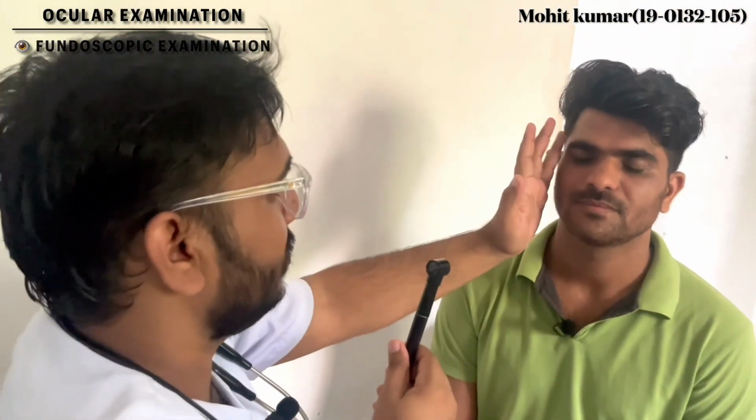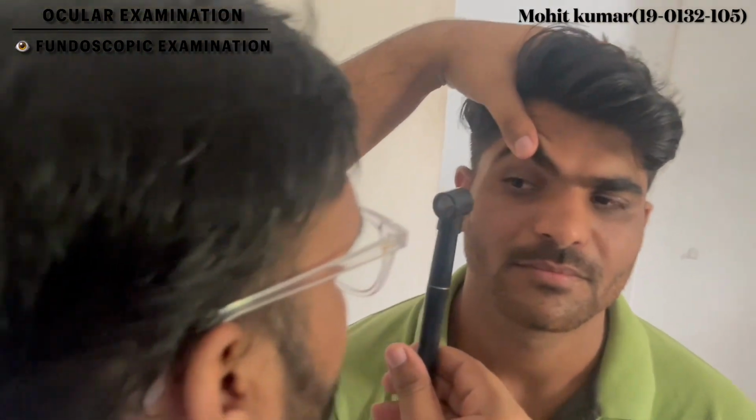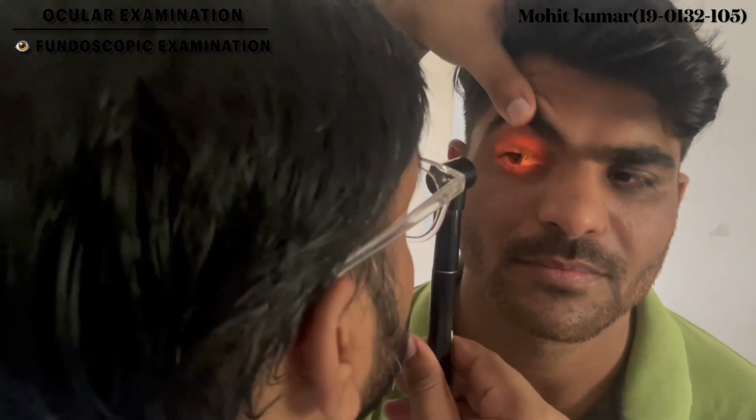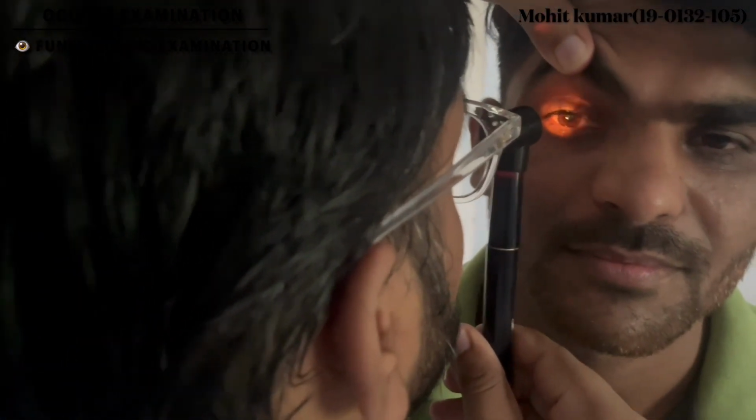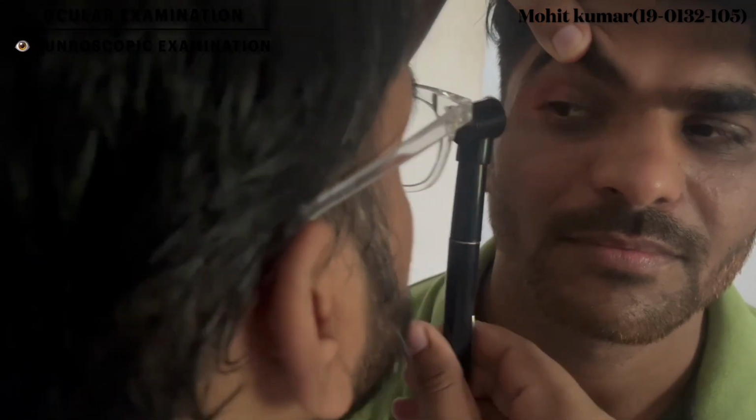Before starting fundoscopy, we also have to turn off the lights and make the room darker. So sir, you have to look laterally, because I'm going to do the left eye first. Okay, now we're going to check this one. You have to look to this side.